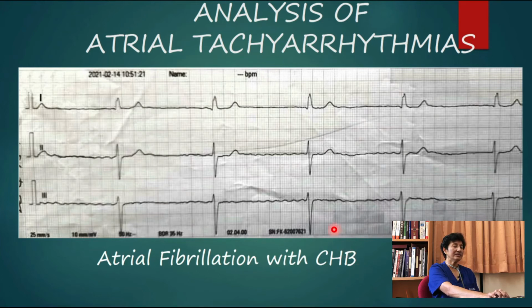When you analyze the ECG, you may find the cause of both of these, atrial fibrillation and complete heart block. You may see evidence of ischemic heart disease. As an example, if patient develops acute ST elevated inferior myocardial infarction, total occlusion of the coronary artery is above the AV nodal branch of the right coronary artery. Patient will develop complete heart block and ischemia may induce atrial fibrillation.